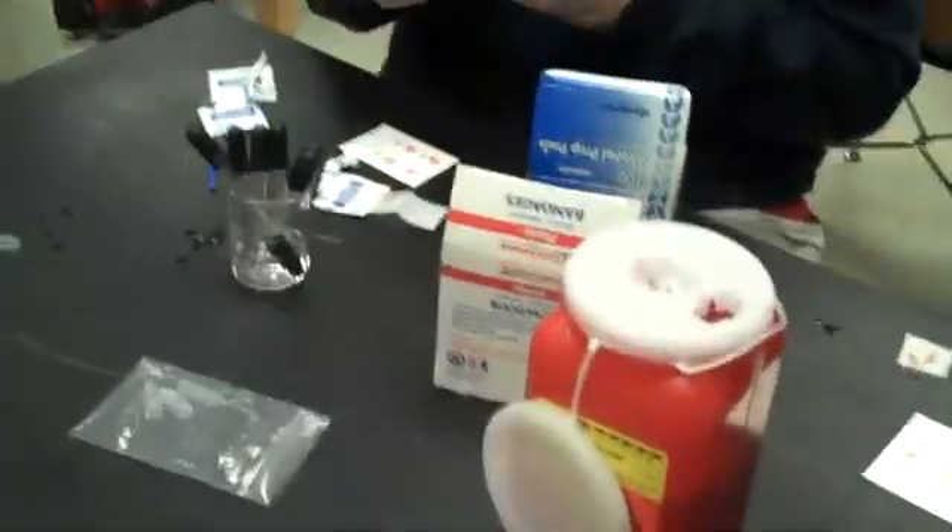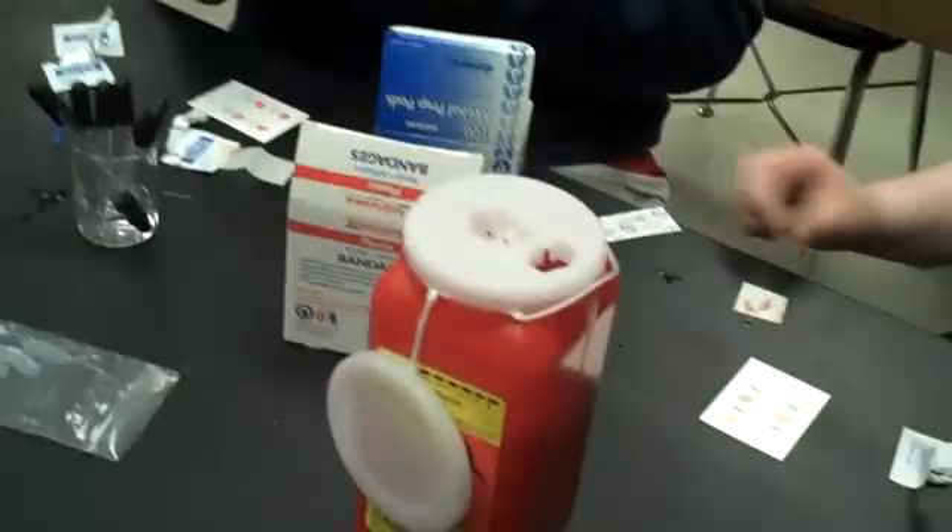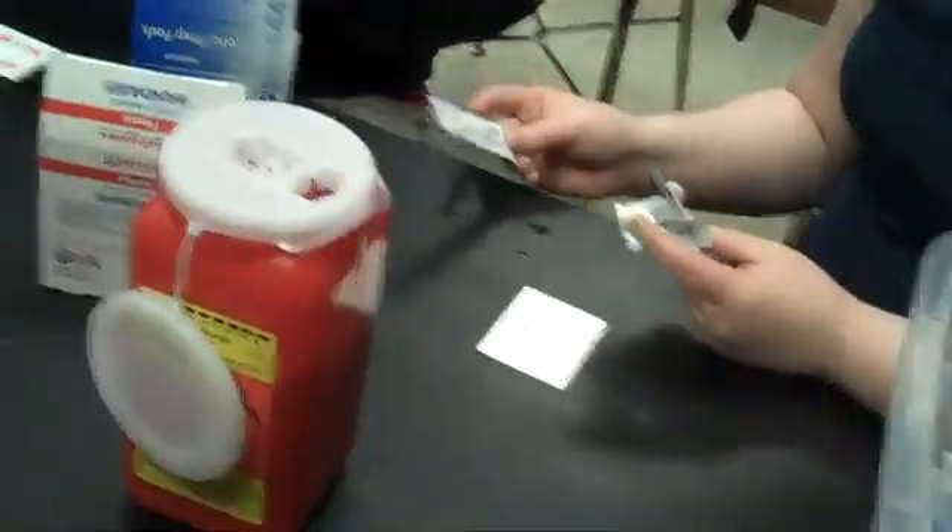Do you want to take a kid home and test their blood too? My mom's a nurse — she might have better ones they get from the hospital. Oddly enough, the hospital kits look exactly the same. You need to get the rear part — let's try it on.